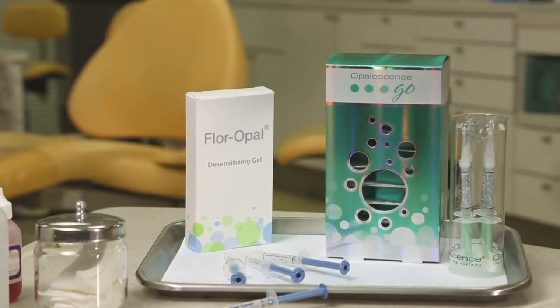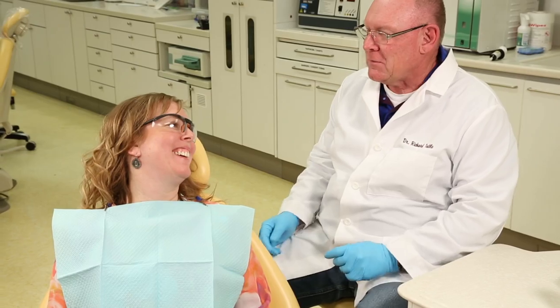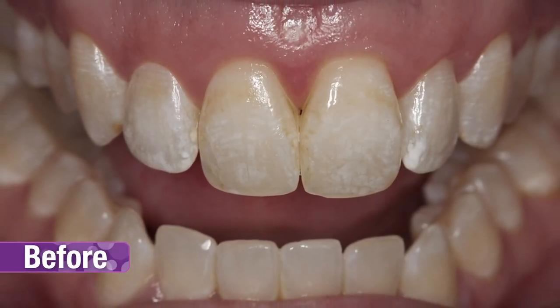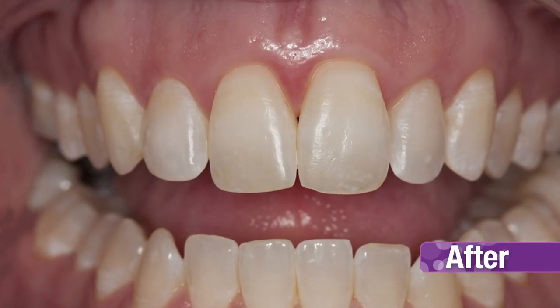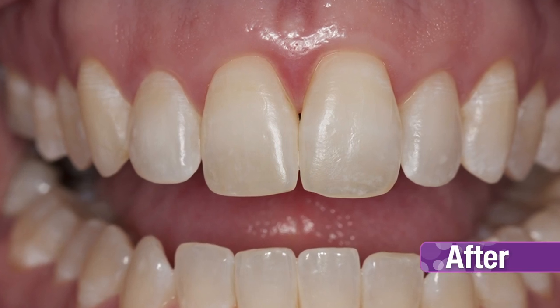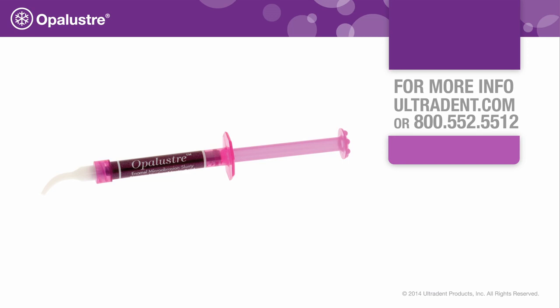If the patient is experiencing any sensitivity, wait 24 hours before using take-home whitening products. Take post-op photographs to record the outcome. In this case, a single office visit resulted in significant improvements to the enamel. Contact your Ultradent representative for more information on Opal Luster and our entire menu of whitening treatments.